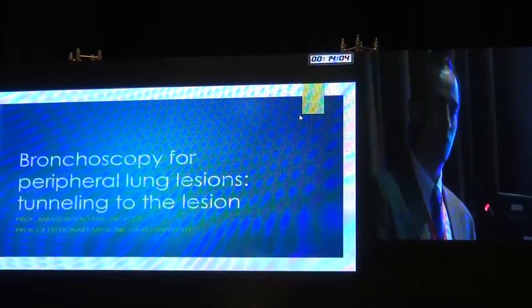I just want to take you back for some time, and I will show you how 50 years ago physicians managed these conditions too. Bronchoscopy is a valuable tool for the diagnosis of central bronchogenic carcinomas, but lesions beyond the central airways, the peripheral ones, represent a challenge to the bronchoscopist. Various techniques were discussed today before: the BAL cytology, transbronchial lung biopsies, fluoroscopy guidance, ultrasound guidance, electromagnetic navigation, and also transthoracic techniques under CT or ultrasound guidance.